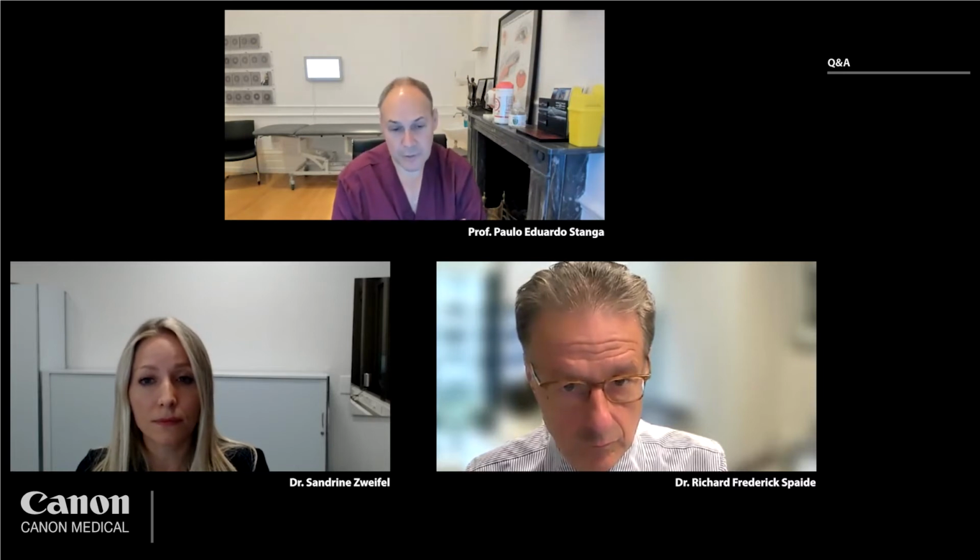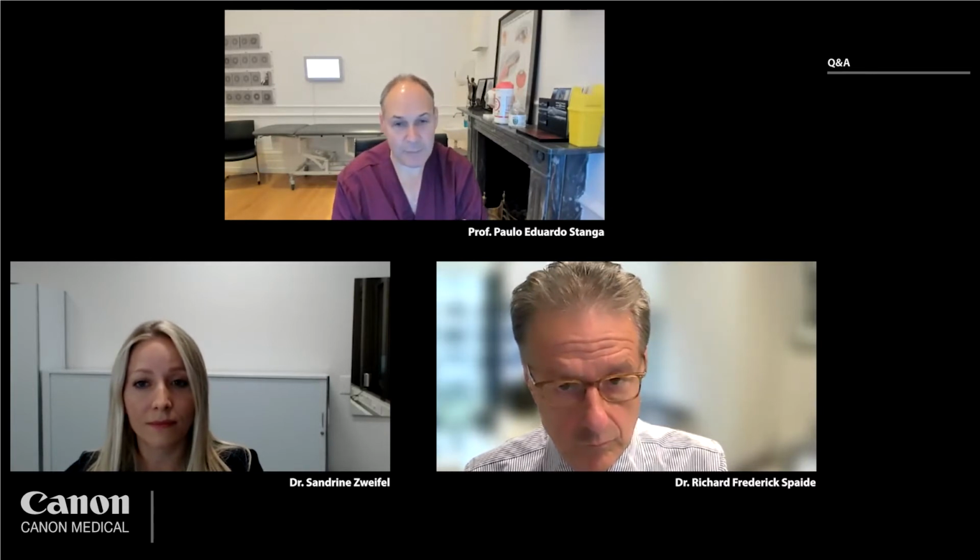Well, that's a bit answering my question. My next question, for both of you: what tricks do you have for patients with, for example, diabetic with no vision, when you want to do an OCTA?